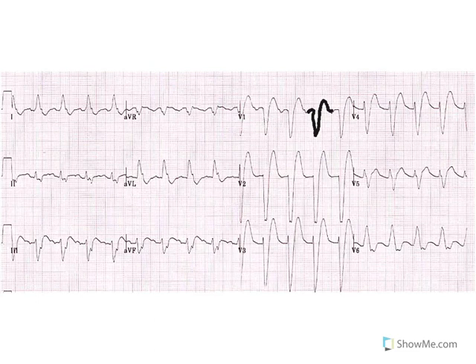Now, if I look at leads 1 and V6, all of that energy is going to go from the right side of the heart over here to the left side of the heart. So all of that energy is going back that way, and if that's lead 1, this can be V6.